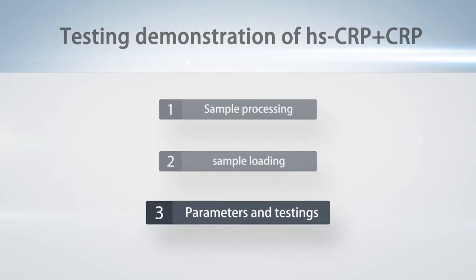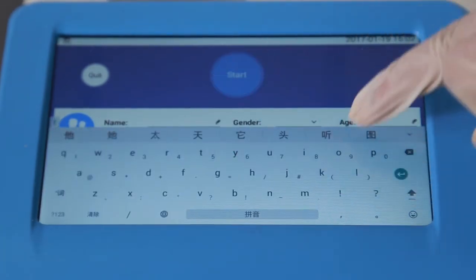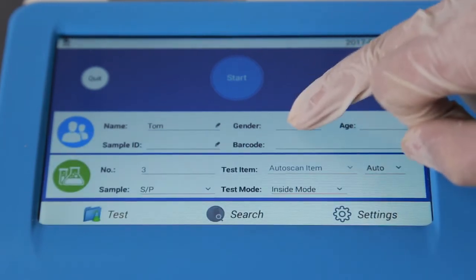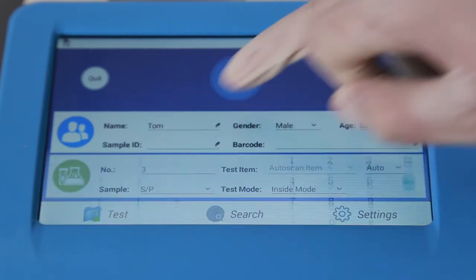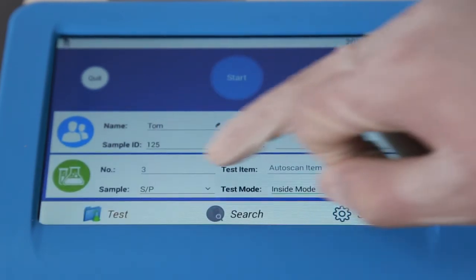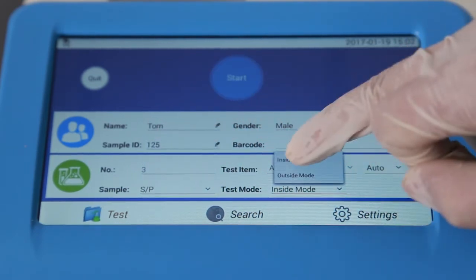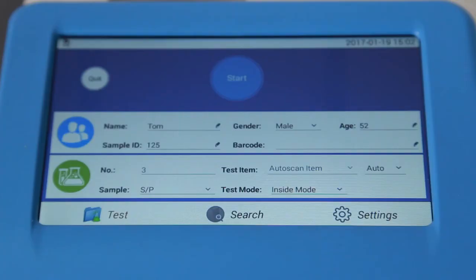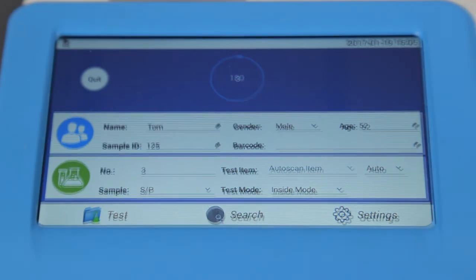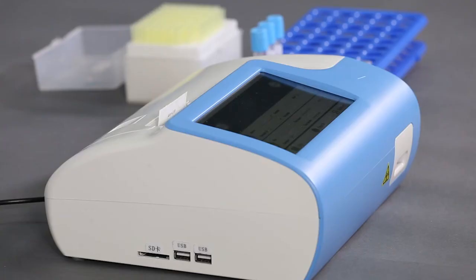Step 3 – Parameters and Testing. Set up the parameters: input patient information including name, sex, age, and ID. Choose serum/plasma and inside mode. Insert the test cassette into the slot and press Start to automatically run the test and print the results.